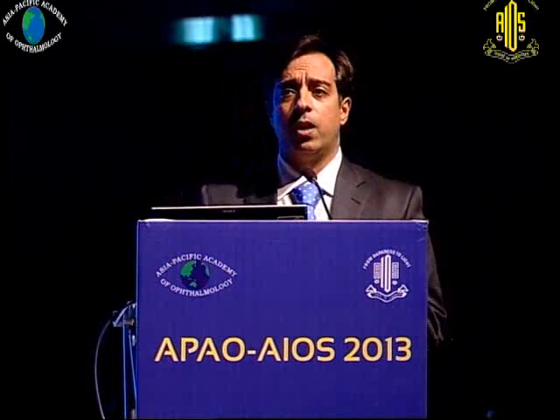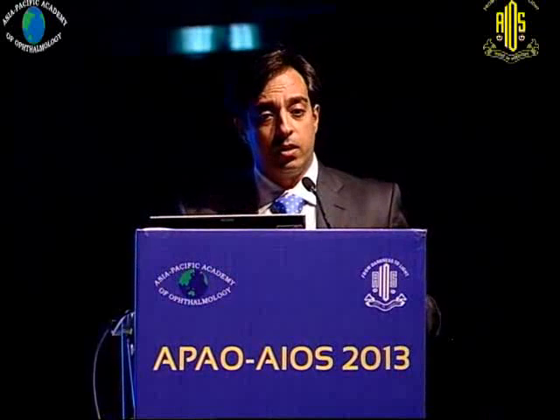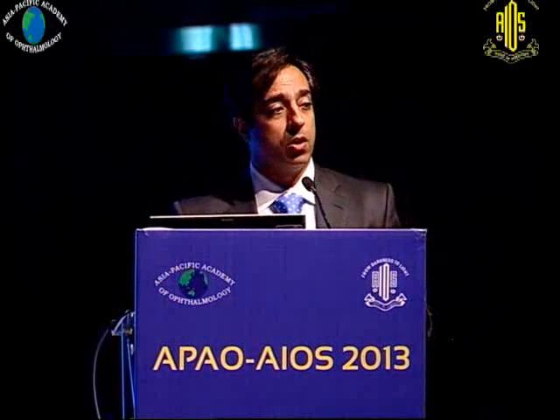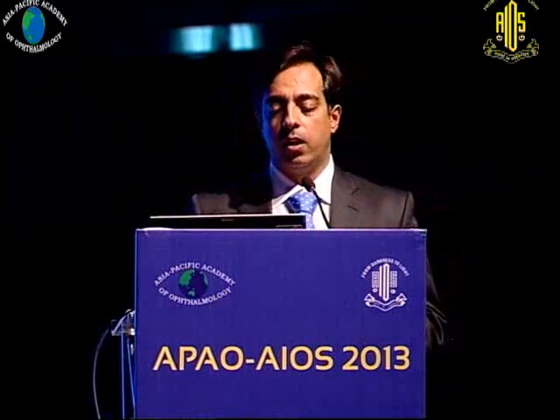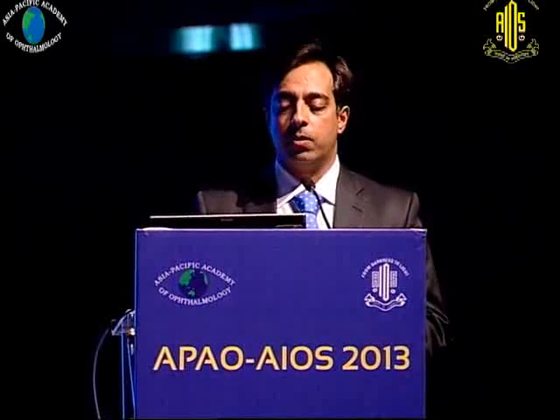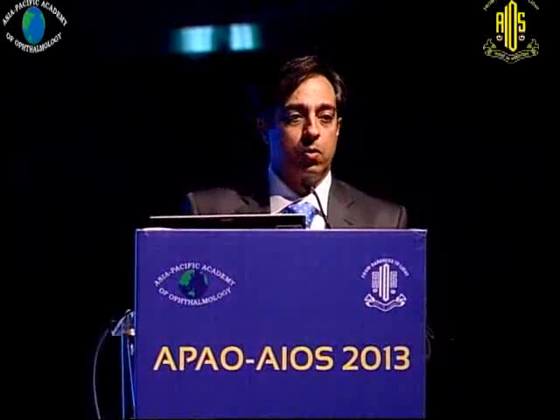But of course we know that whenever we create a hyaloid detachment, we are actually doing something pathological by itself, because we are removing a tissue forcibly, and it has its own consequences in some cases. A simple case of macular hole where we have just removed the hyaloid, PVD creation, and when you screen the inferior periphery, you might see these small collections of fluid or operculums, and this is something that we all dread to see, because it was a simple, straightforward case, and now you are seeing small breaks, and these are potential for a patient coming back to you with a detachment.